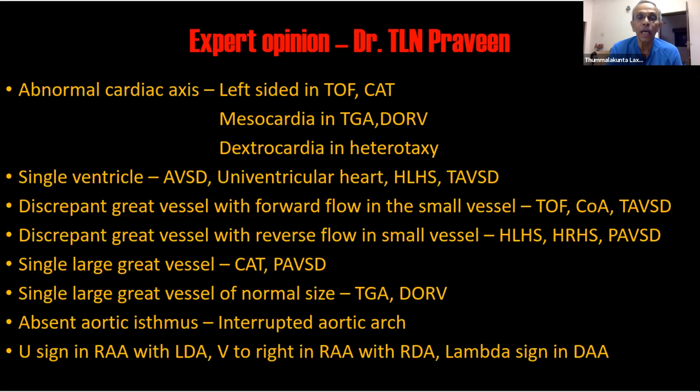That is the reason why we need to make this evaluation of the fetal heart in the first trimester a mandate. It is essential that you try to evaluate, particularly when you get a fetus at about 12 to 13 weeks, and it's ideal to do a transvaginal examination to evaluate various structures, not only the heart. With this transvaginal approach with high frequency transducers, certain unmodifiable factors in evaluating structural abnormalities can be overcome by using this particular technique.